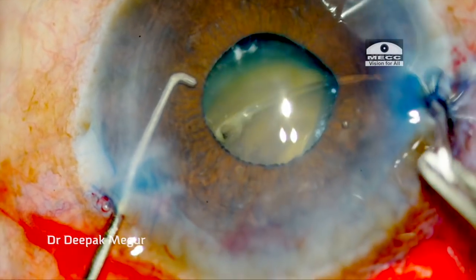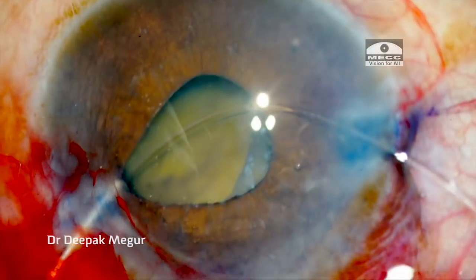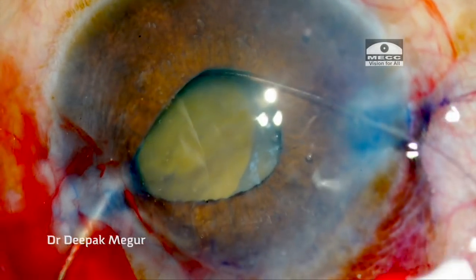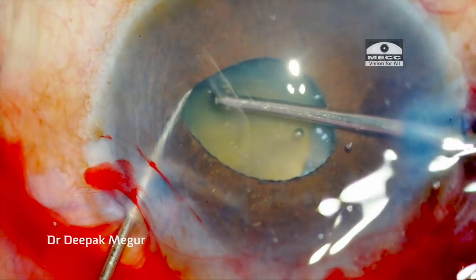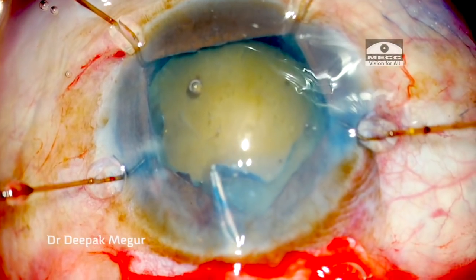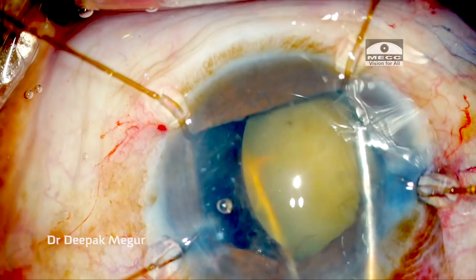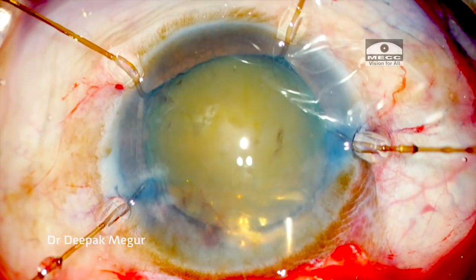I realized my mistake and come back to reintroduce the CTR. I am using my Sinskey hook to retract the pupil a little bit so that it guides me to the exact position. The capsular knuckle we see indicates that the ring is in the right plane and under the rhexis margin. With great difficulty the ring could be manipulated into the bag, and once it gives equatorial support, the secondary rhexis becomes extremely easy. The pupil was expanded using iris retractors and the secondary rhexis could be managed very easily. The bag was saved because we could extend the rhexis to a larger secondary rhexis, which was possible only because of the timely insertion of the CTR. Had I used iris hooks beforehand it would have been much simpler.